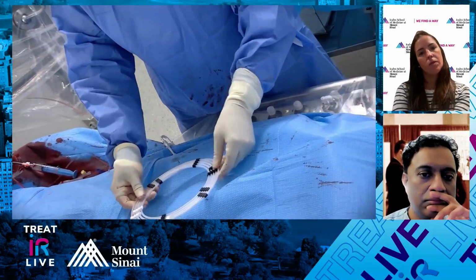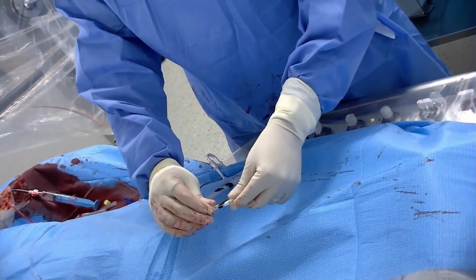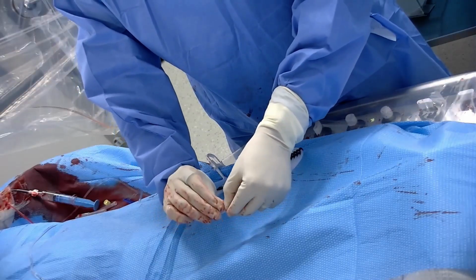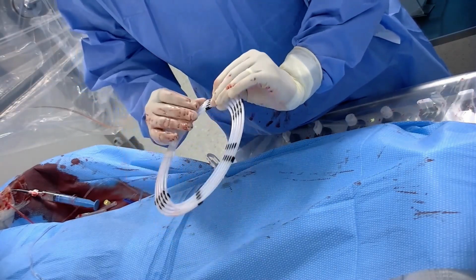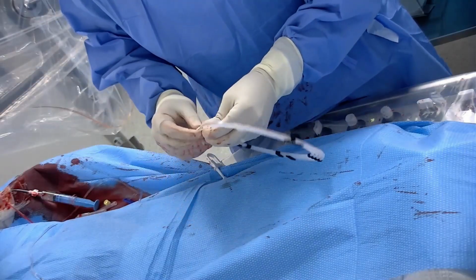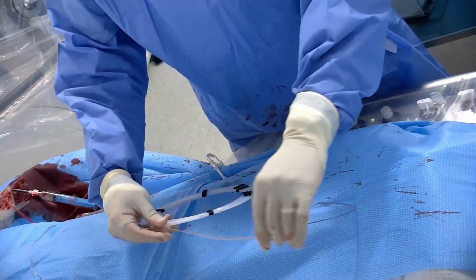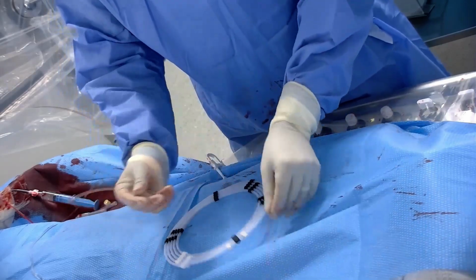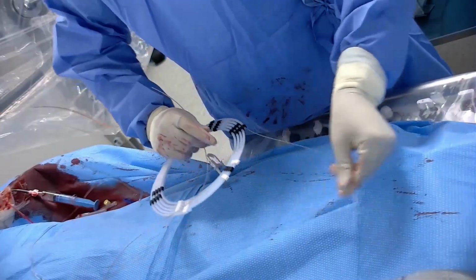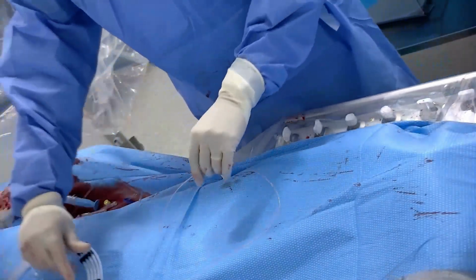So I don't know if you guys can see. This is how the coil comes. It looks exactly like their normal pod coils. The only thing is it comes out a little differently from the hoop. So we're going to unlock this. Yeah, here we go, it comes up. And so it comes out front end first. It comes in this sort of orange casing, and then it comes out there. There's no friction lock like on the other one, so it will slide in and out.